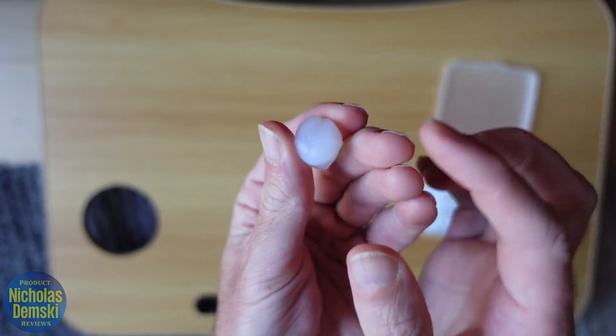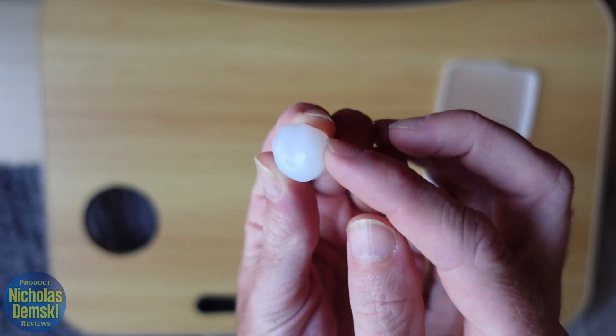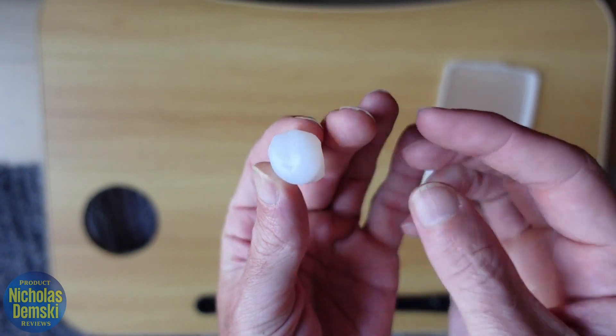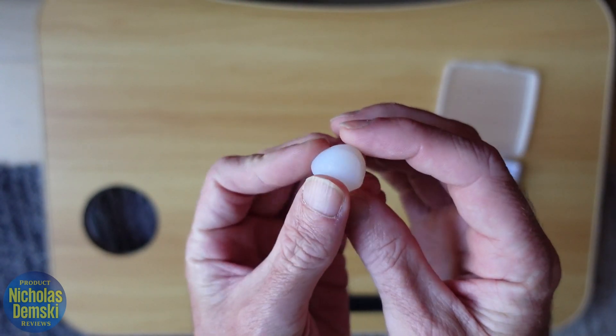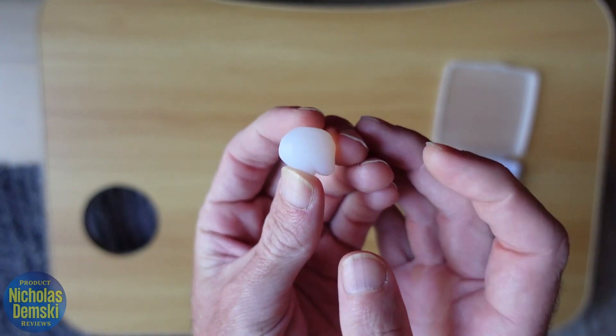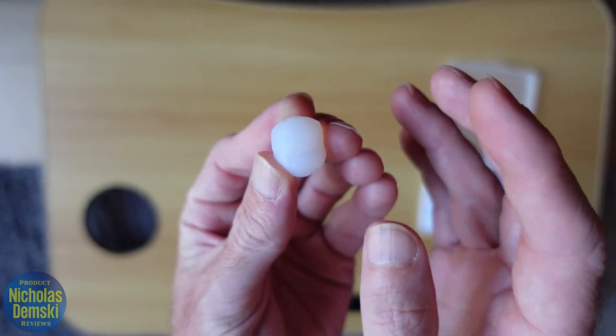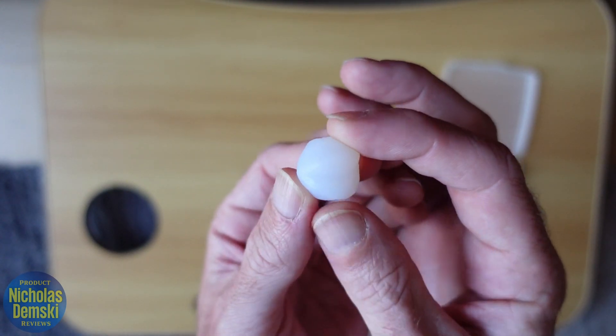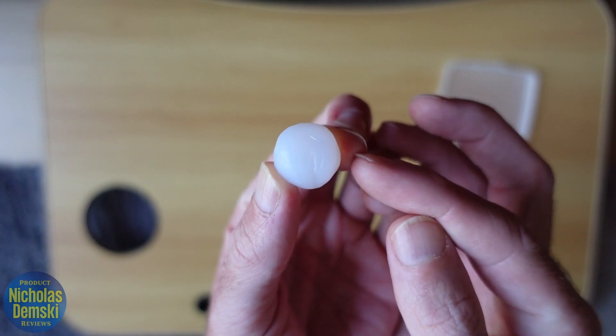I want to show you how to put it in my ear, but first I want to tell you that I started using these because I moved out of the countryside and into a city, and all the noise is really difficult for me. Finding these earplugs and using them to sleep every night has been great — they definitely work and help me sleep through the city noise. Let me show you how to put them in your ear.